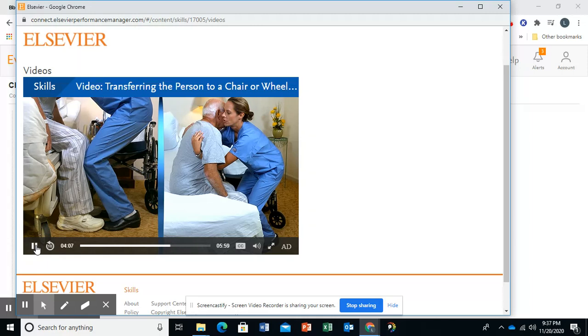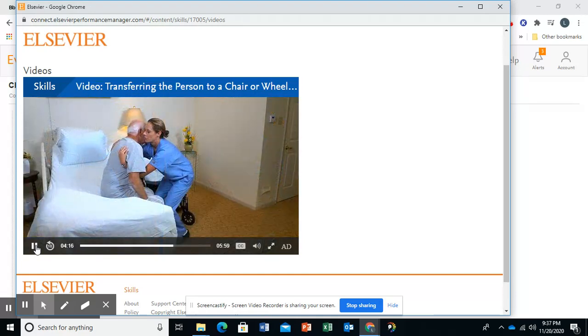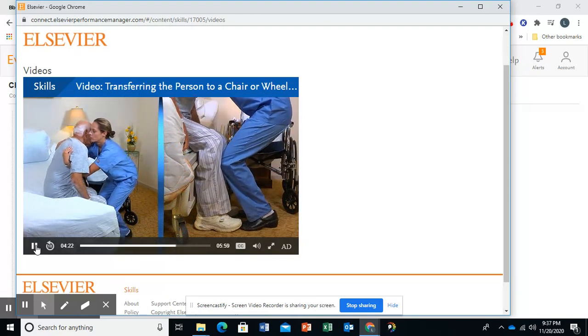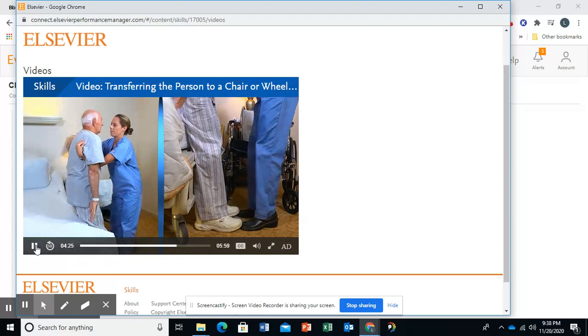Place your other foot slightly behind you for balance. Or use another method, such as straddling your legs around his weak leg. Explain about the count of 3 as shown earlier. Then, on the count of 3, have the person push down on the mattress and stand as you straighten your knees to pull him up.